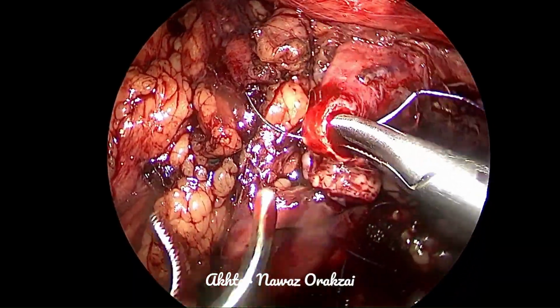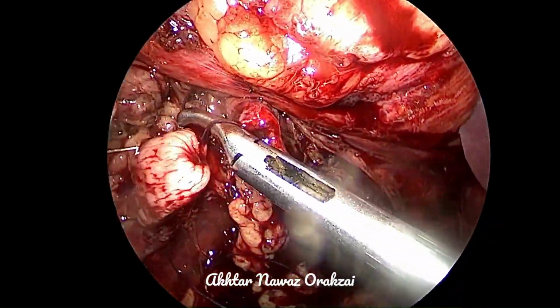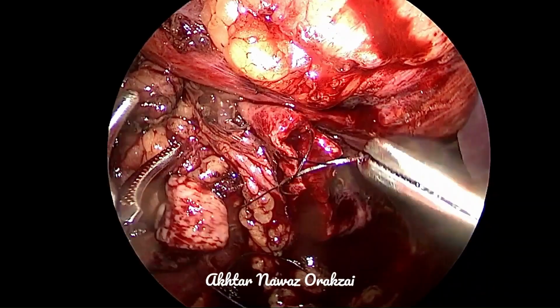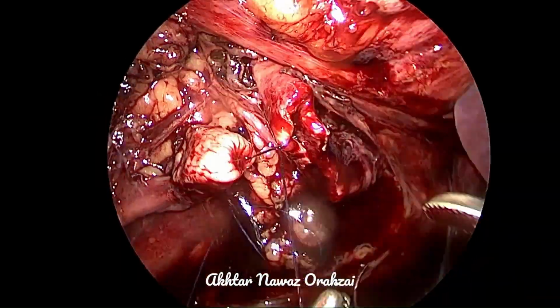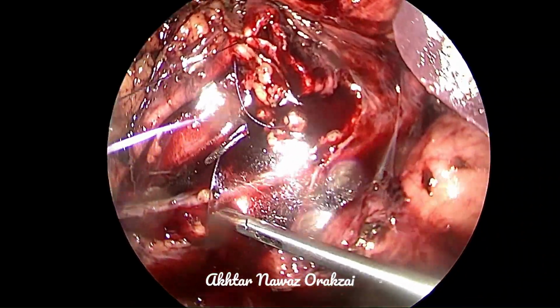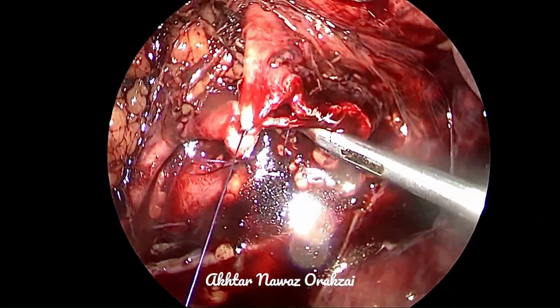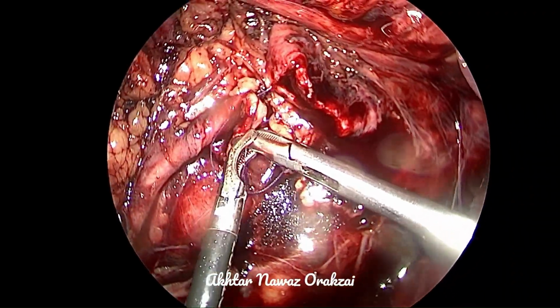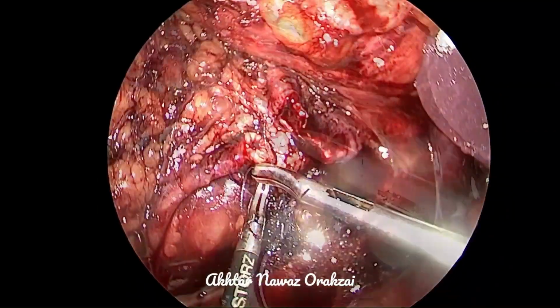So multiple factors come into play then. First one is the anastomosis is usually under tension. Number two, this tension leads to ischemia of the ureter. And when there is tension, there is a tendency that we have to mobilize more of the ureter.